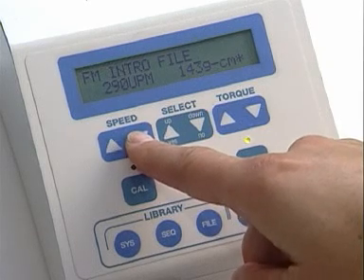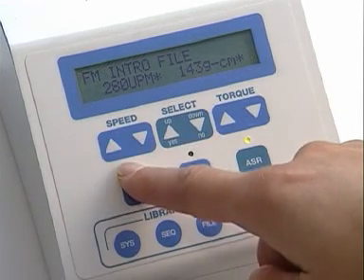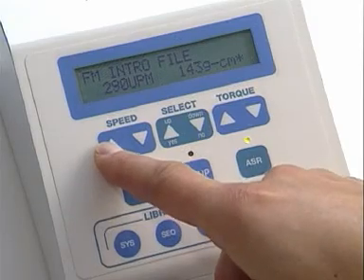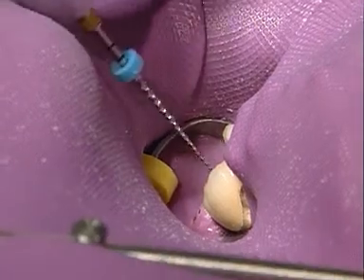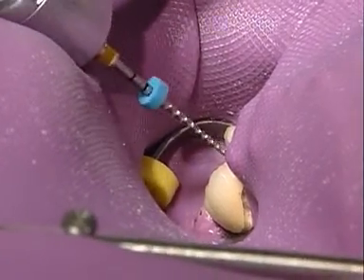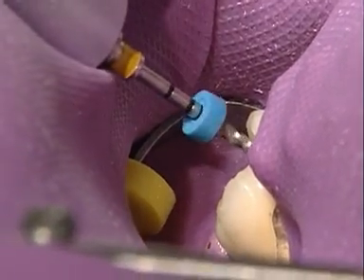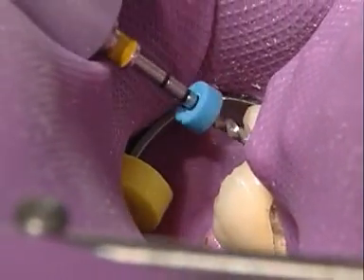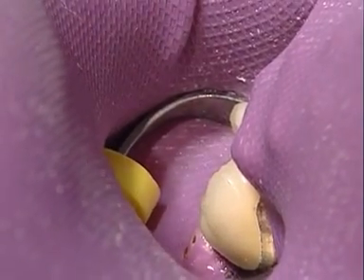If required, speed and torque values can be reduced or increased. The Auto Stop Reverse function of the Endo-IT Professional automatically reverses the direction of the instrument as soon as the preset torque limit is reached due to friction.